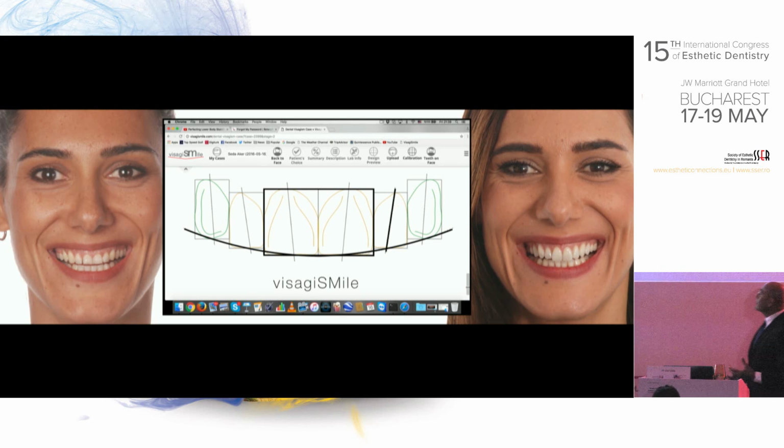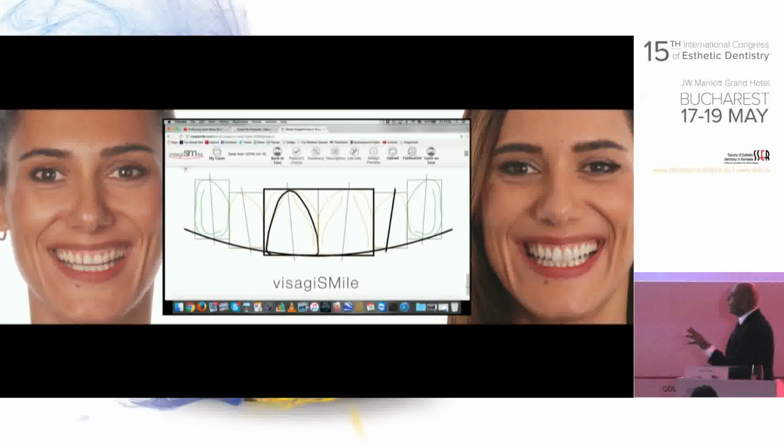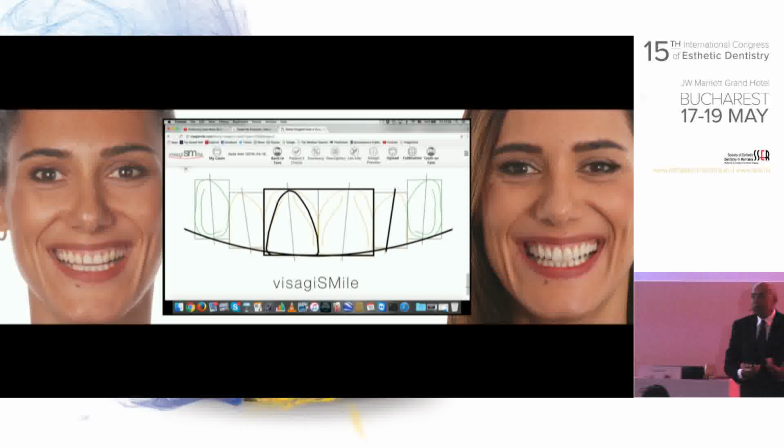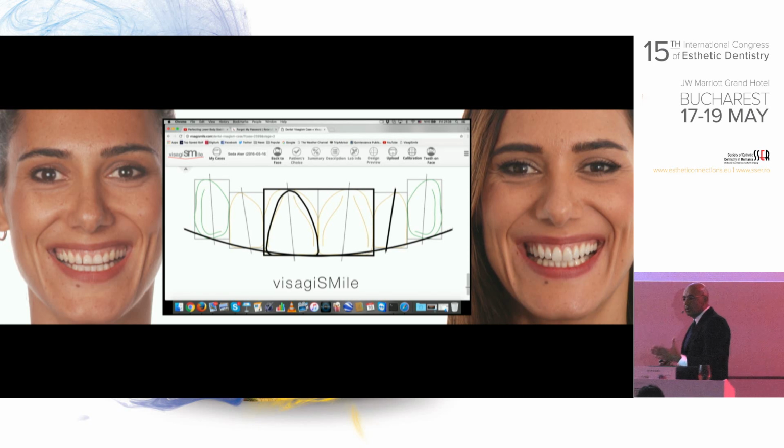It tells me about the tooth inclination. This is how we design the canines, and the individual shape of the teeth, which is triangular, the final design. So having these clues in my pocket, it was so easy for me to start doing my direct mock-up, sending it to the lab, them doing the wax-up, and then the porcelain afterward.